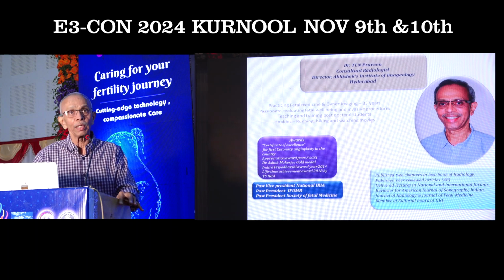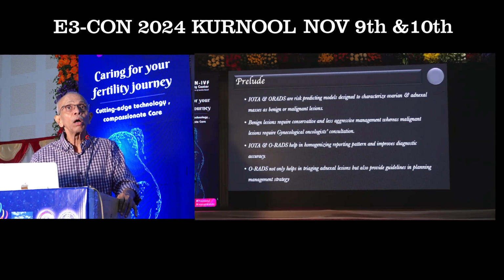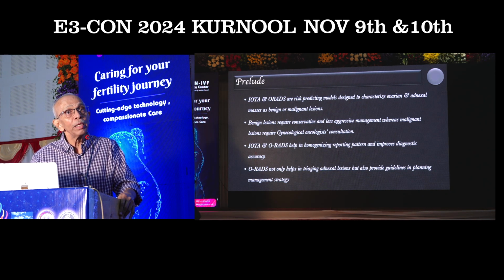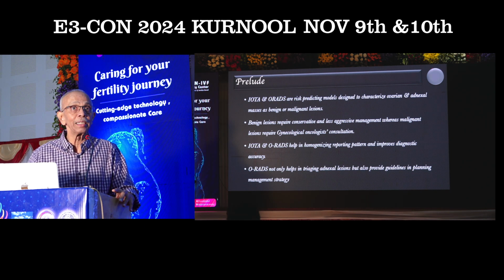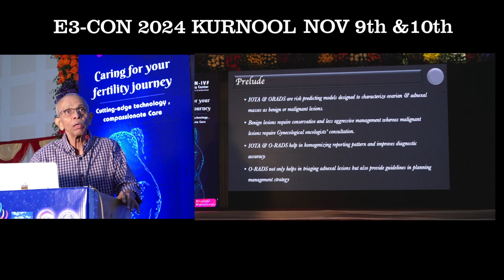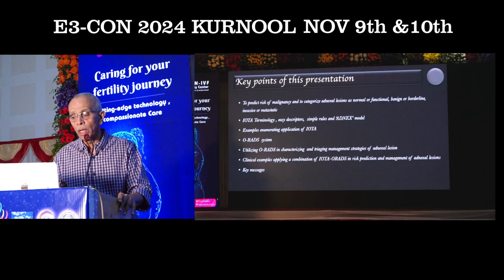That is one most important thing. Now, with the ORADs being added to the IOTA classification, it has enhanced our ability to plan surveillance and management of these adnexal lesions. That is one of the additional features that we have with the addition of ORADs to the IOTA group classification.